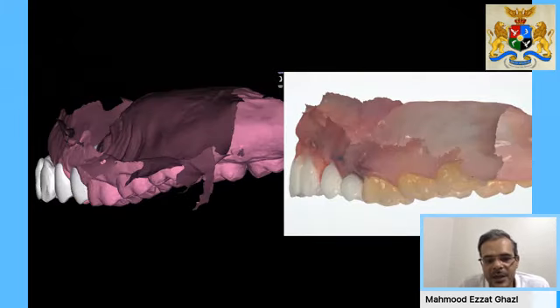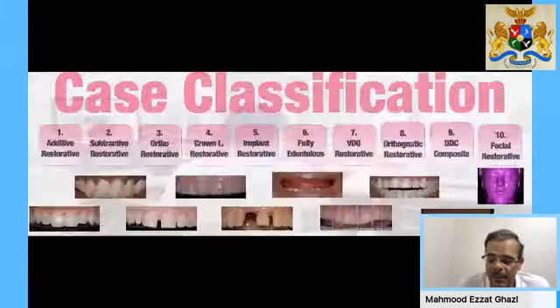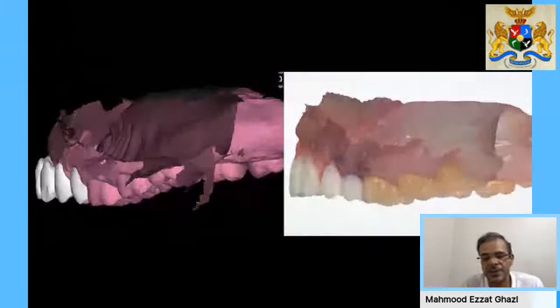And you could see here, this is the total big difference between, on the left of my screen, the wax up and intraoral scan before, and this is the hybrid prosthesis after we had regenerated the bone horizontally. This patient is till now in temporary, and this is the result that we had reached for now.